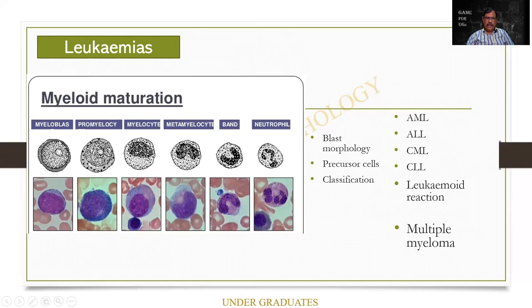It has got a large nucleus. There can be 1, 2, or even 3 nucleoli. This is a nucleolus that is there. No granules. Promyelocyte is also a large cell, and I am finding granules as well as nucleolus. Myelocyte downwards, I find that there are specific granules. The nucleolus is not clear. The nucleus becomes smaller. The granules are more specific. Specific means neutrophilic granule, eosinophilic granule, etc.